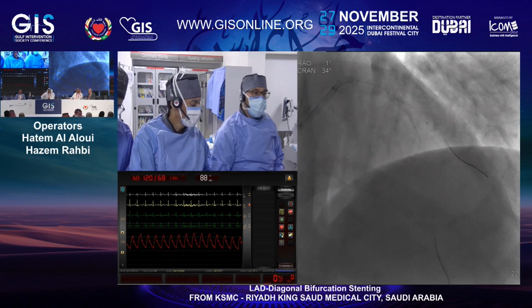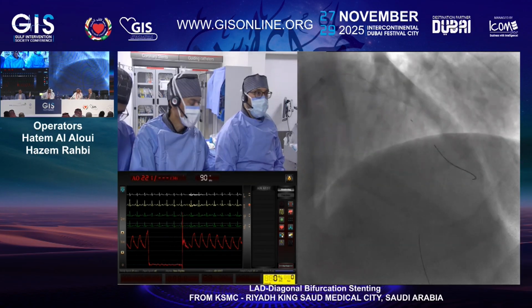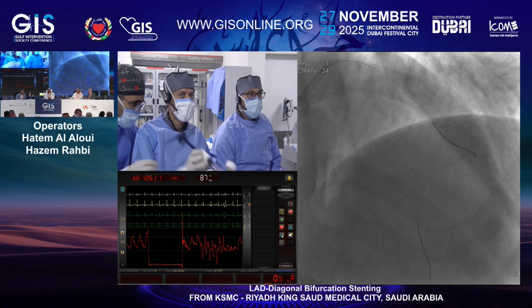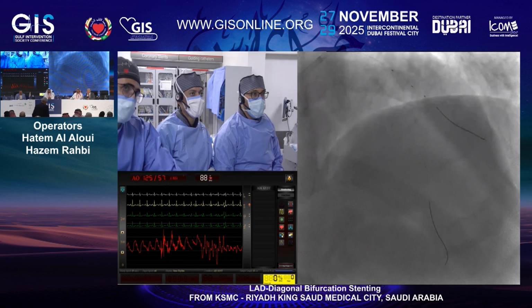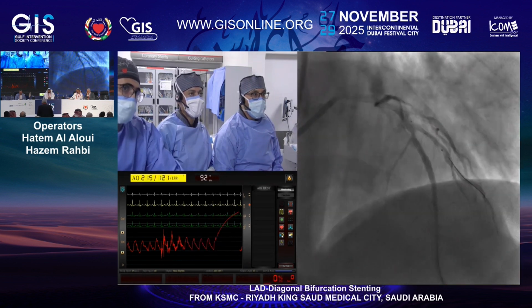And you have the results of the SCAR registry as well. Yes, it's very good results. So bifurcation lesions were not included. Now we are going with the DCB. What's the size and the length? So it's a 3.0 by 20. Small test, please. I think we are fine here.